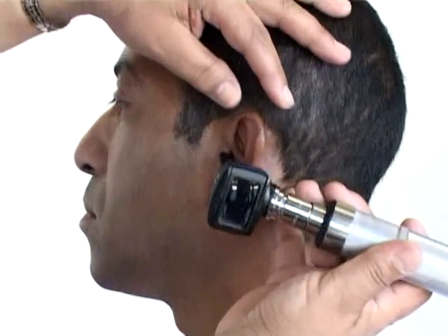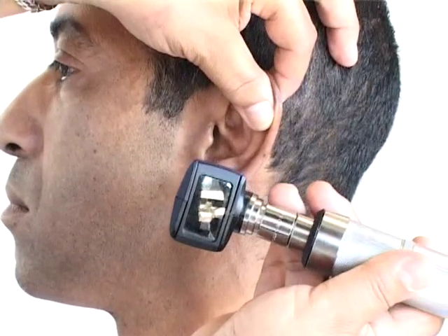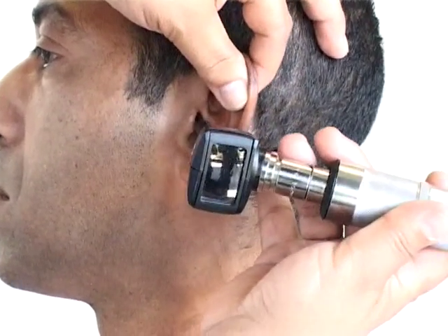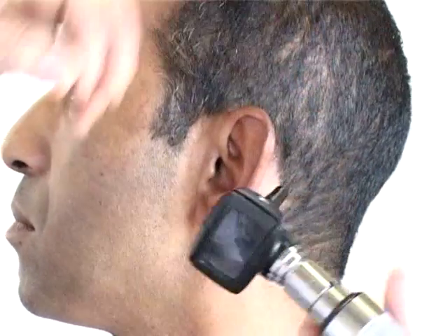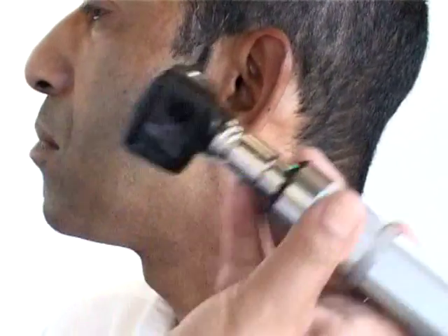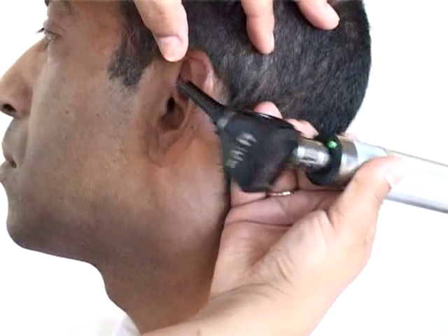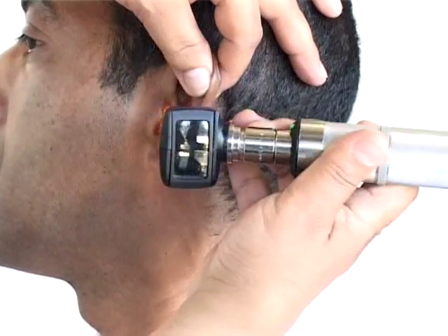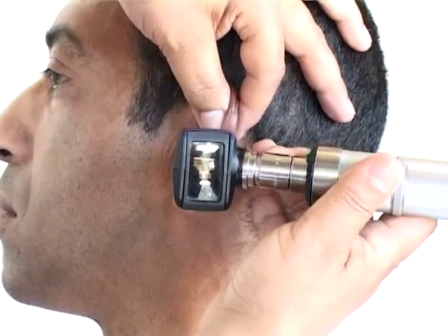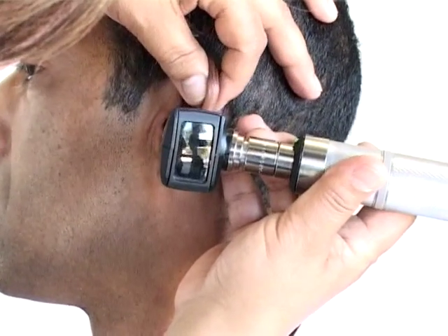To insert gently, lift the ear up and back for the adult. Insert it gently into the ear — remember, don't insert without the light on, so make sure the light is on. You can also use your guiding hand to support at the back so that you don't hurt the patient in case the patient jerks around. Insert it gently and carefully.